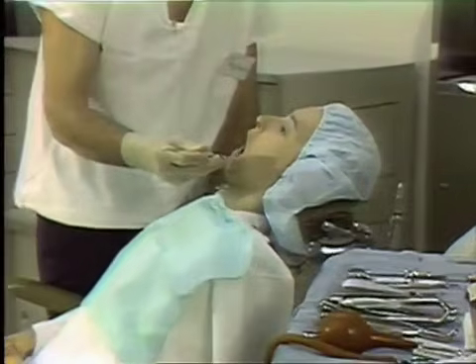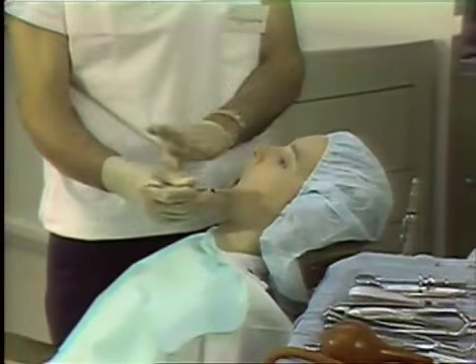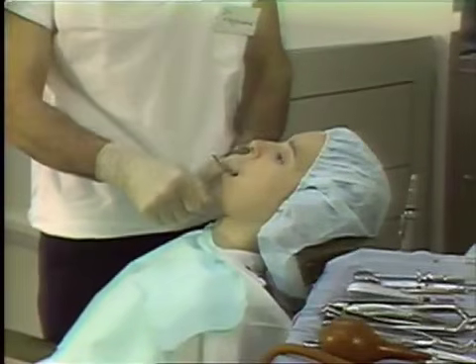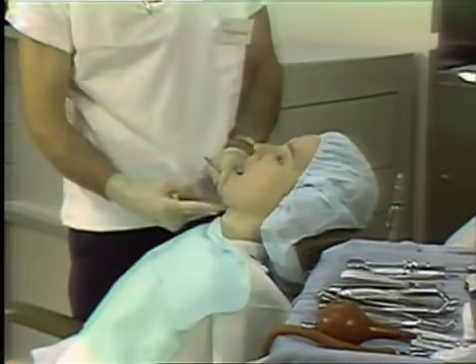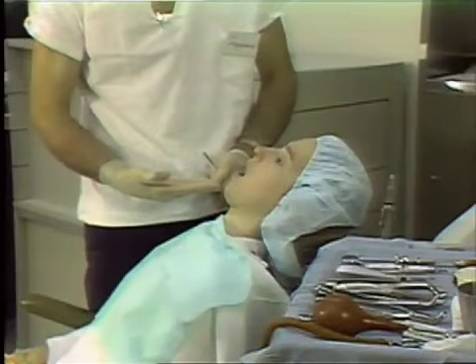the level of the operating field should be so placed that your hand level is lower than your elbow. In that manner, you can work directly and you won't be at an awkward angle. So in the mandibular arch then, with the patient's mouth open, the mandibular occlusal plane should be parallel to the floor.